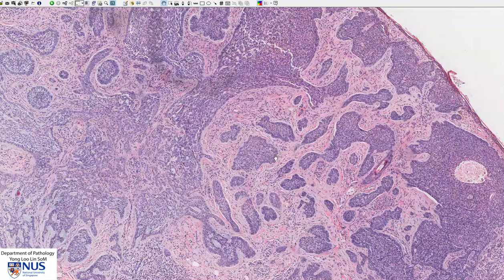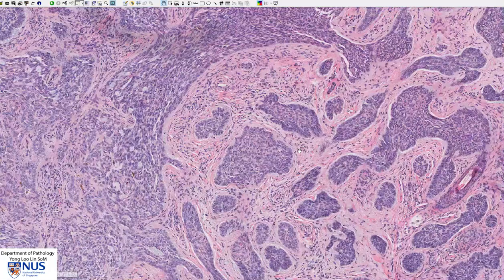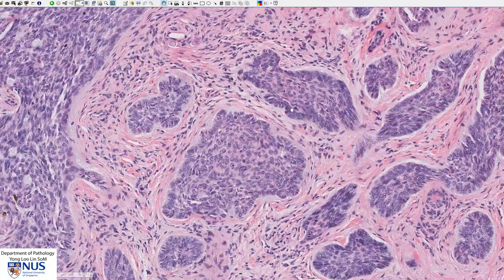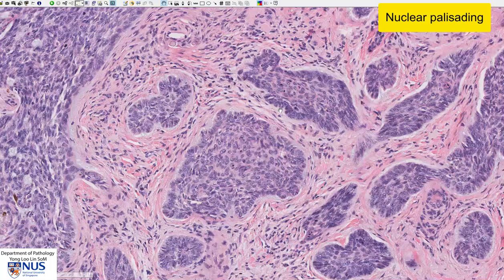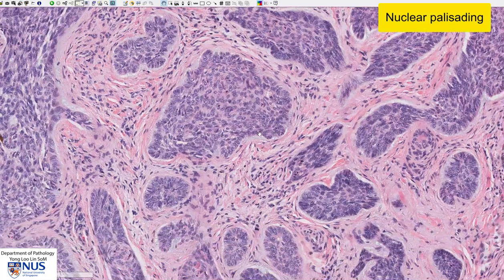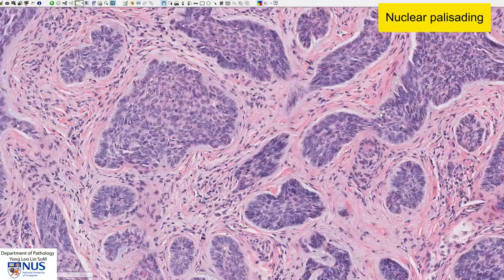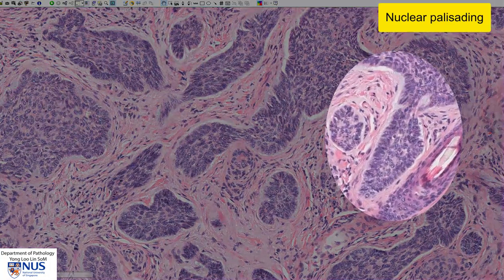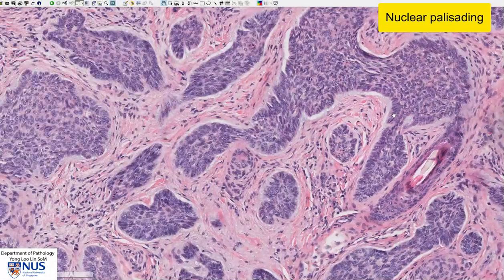One very striking feature is that at the edge of these islands, the nuclei tend to line up vertically. You can see this here, here, here, and you can also see it very clearly here. And this is known as nuclear palisading.